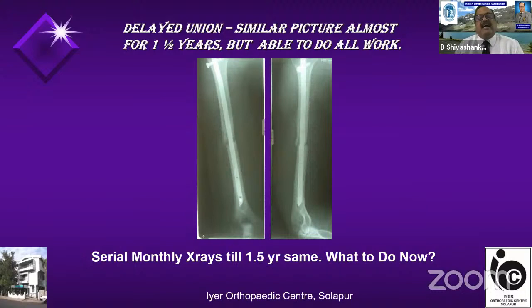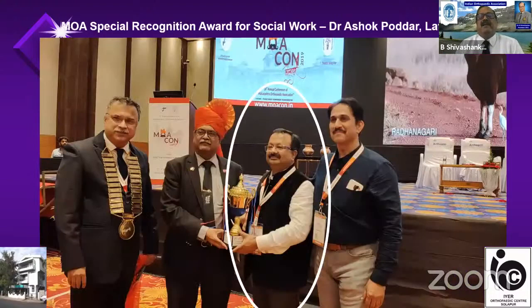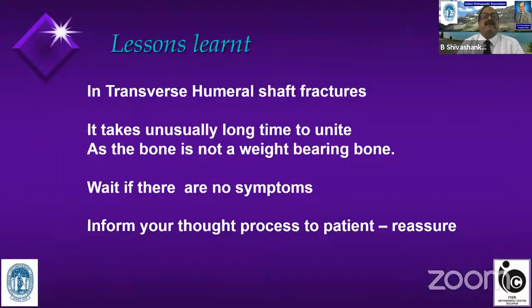Then I went behind him and asked him to get an X-ray, and after 10 years, he took an X-ray in 2013. You can see that the fracture had consolidated. So the fracture which had not healed for almost 1.5 years has healed over time. So seeing X-ray union sometimes in nailing will be difficult. This is the same person, Dr. Ashok Poddar, on whom I operated on the right arm. That's the same case I was talking about. This is the X-ray of Dr. Ashok Poddar 10 years after nailing. It didn't show union for the initial 1.5 years, and showed union at a later date.